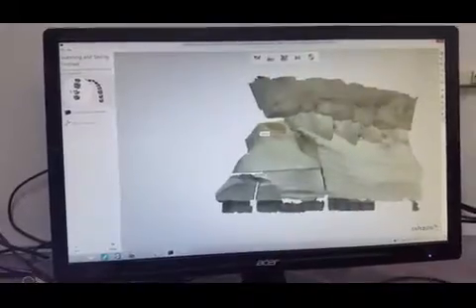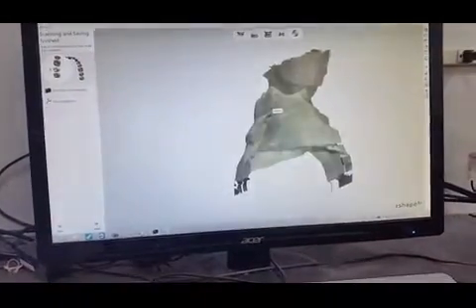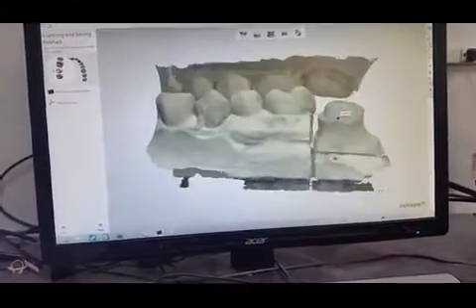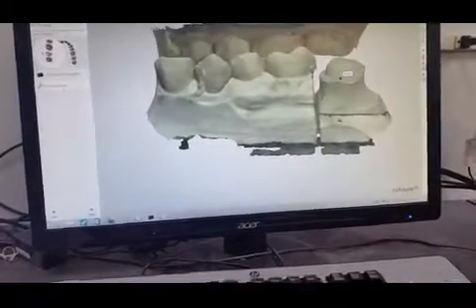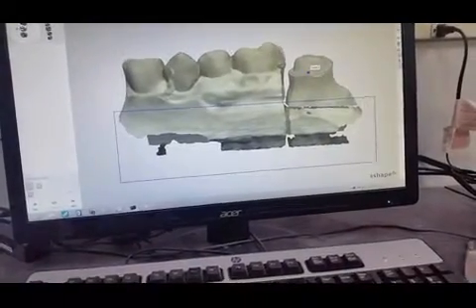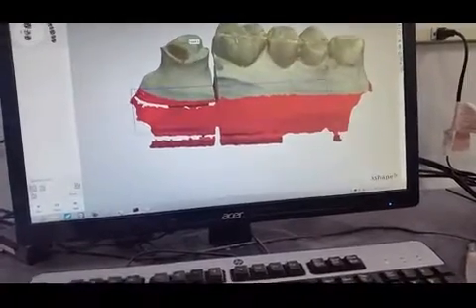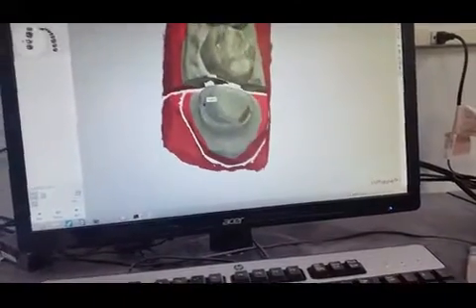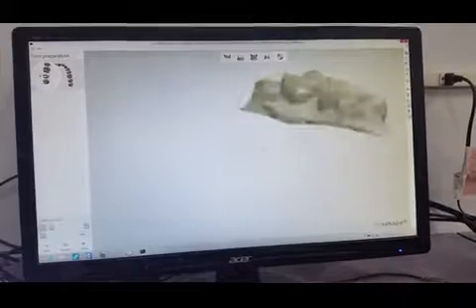Now I usually just kind of go around and look at the margin all the way around, make sure there's no distortion. This one looks good. So there's an option here before we proceed to the design, which is to trim any unnecessary data like we did with the opposing on the prep side, and that's what I'm doing right now. Let's just get rid of that, and that's close enough.